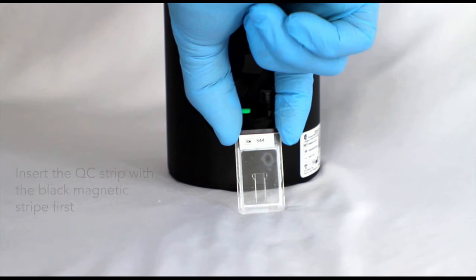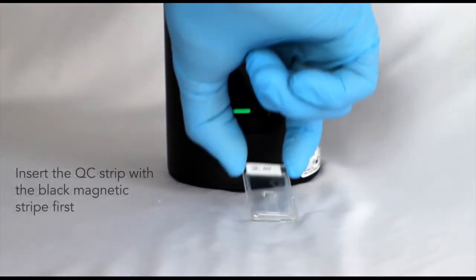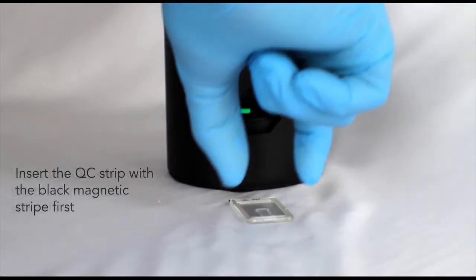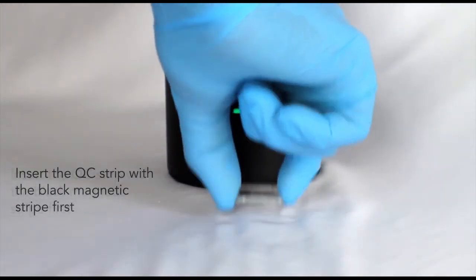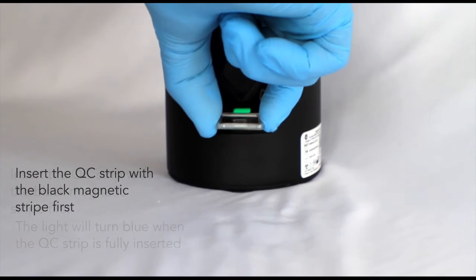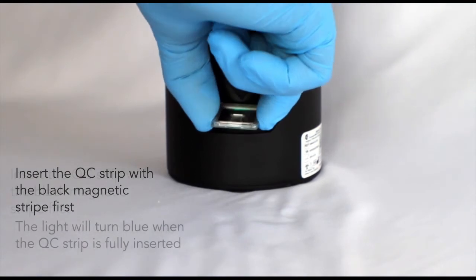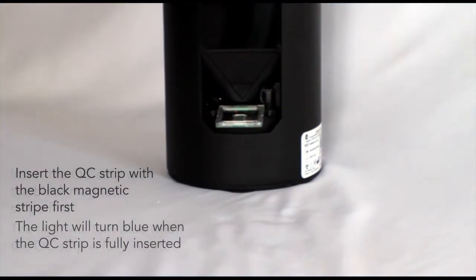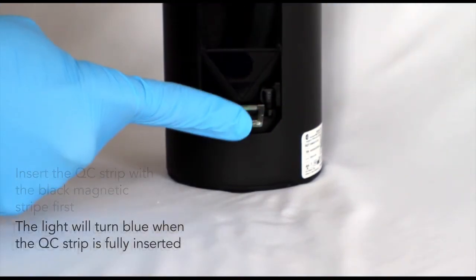Insert the QC strip with the black magnetic stripe first. The light will turn blue when the QC strip is fully inserted.